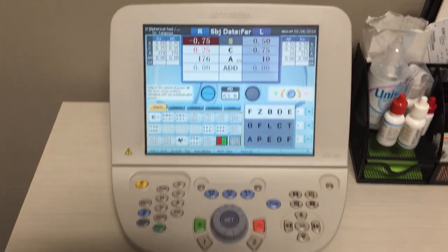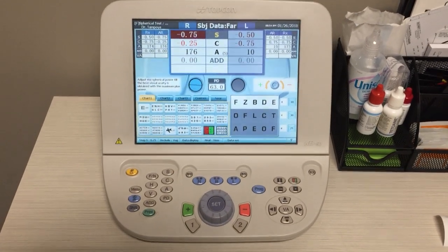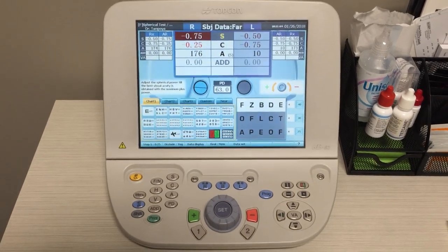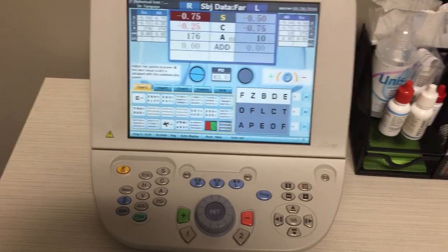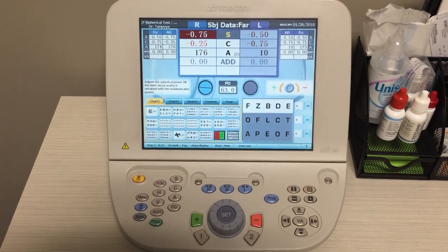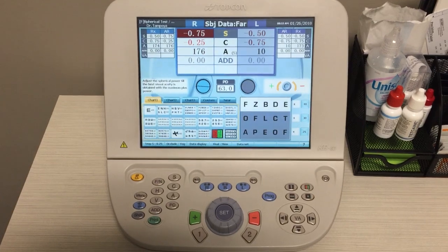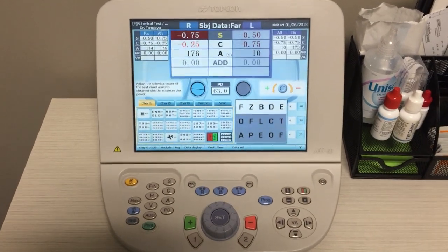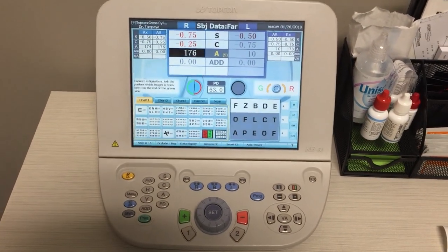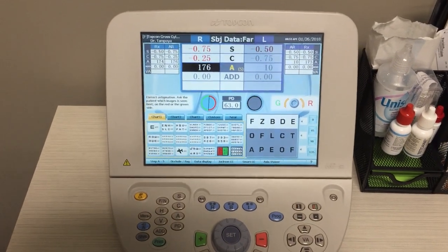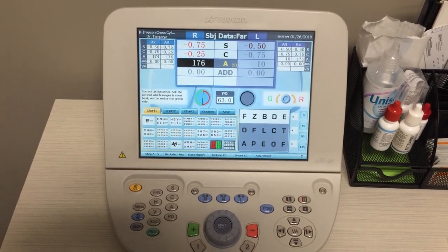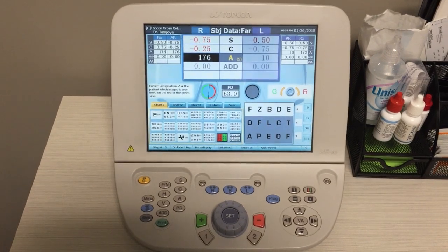You'll hear some noise in the background — that's the phoropter inputting the data and also the PD. Once you're ready to begin, you want to hit the SET button. This phoropter has steps that are pre-programmed; these steps can be changed to your liking, but I'm going to go over what is programmed into this machine right now. By hitting the SET button you'll see that the axis portion for the right eye is highlighted, and the numbers on the right side of the screen are grayed out, which tells us that the left eye is covered.